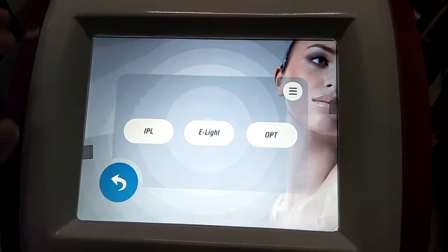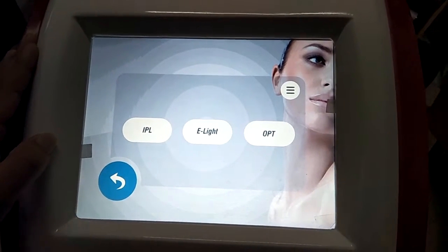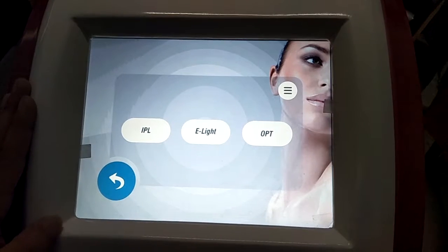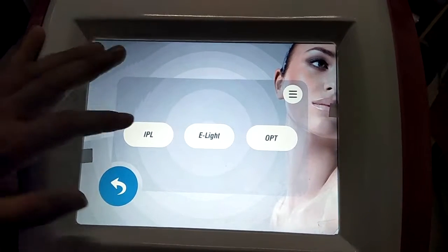Here is the function selection: IPL, E-Light, and OPT. For example, we can choose IPL.